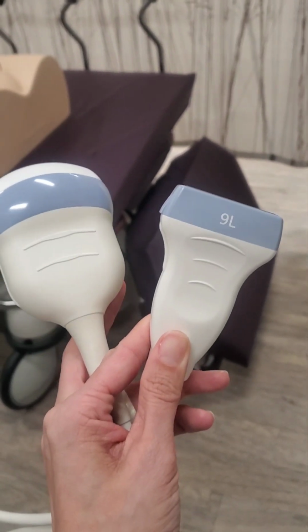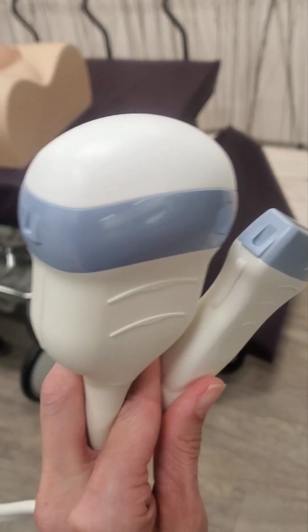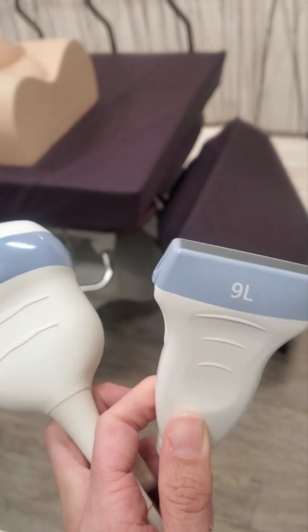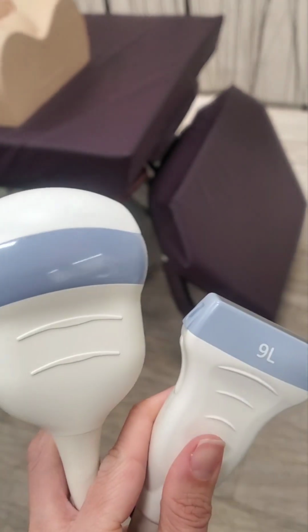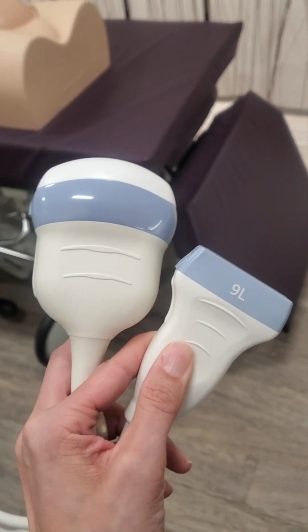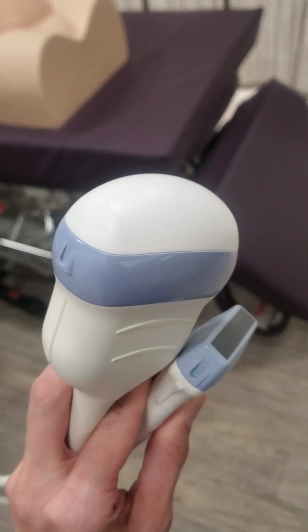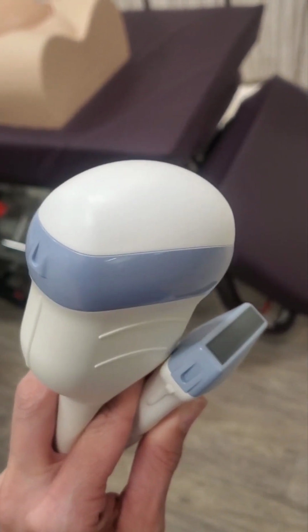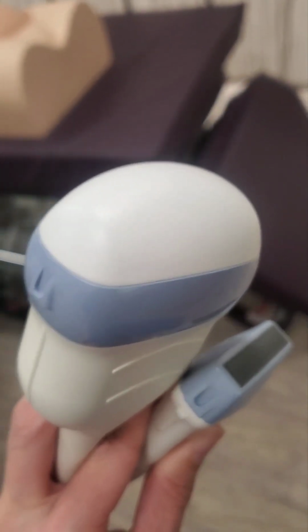Now, just as the sound beam is three-dimensional, and we can scan three-dimensional images and scan in 4D, right? Our transducers are also three-dimensional. And how they are made affects the structure of the sound beam, okay? So you can think about the structure and function of the transducers and how the way that they're built affects the resolutions, the 3 or 4, right, resolutions.